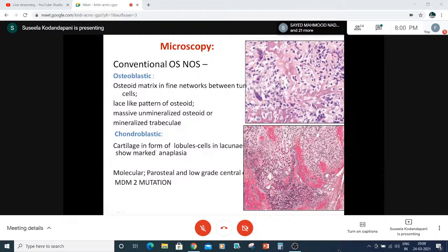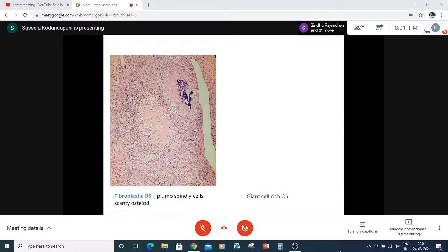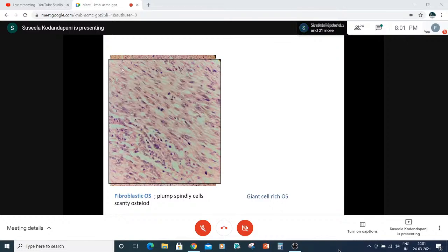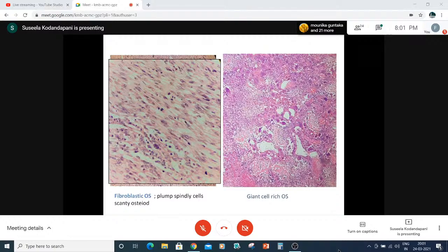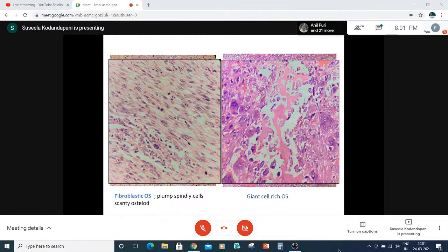Molecular-wise: parosteal and low-grade central osteosarcoma show MDM2 mutation. The fibroblastic variant of osteosarcoma shows plump spindle cells and scanty osteoid. When we get a true-cut biopsy containing only spindle cell population, we call it a malignant spindle cell neoplasm — it could be fibrosarcoma or fibroblastic osteosarcoma. We cannot commit to osteosarcoma until we see the osteoid. In giant cell-rich osteosarcoma, numerous giant cells are seen. When the true-cut biopsy first came, we thought it was GCT, but the radiology showed an aggressive tumor. We asked for a repeat biopsy, which showed osteoid areas amidst the giant cells.